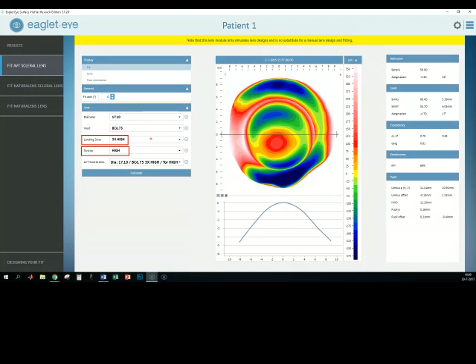In practice, you would need to order a lens and ask your patient to come back. It will take plenty of chair time for you, but your patients should also have a lot of patience, and that might be pretty hard.